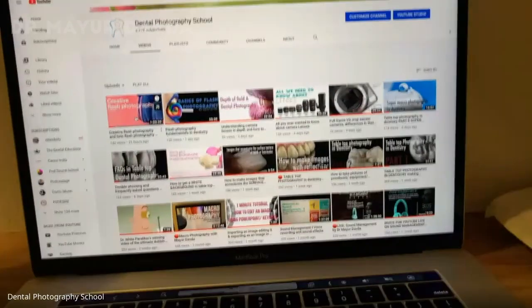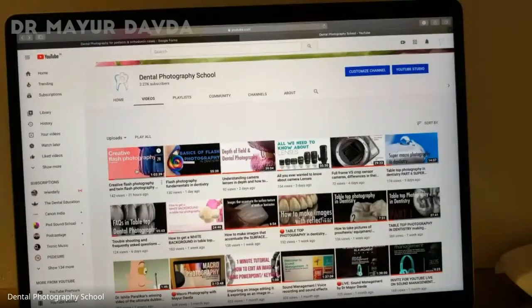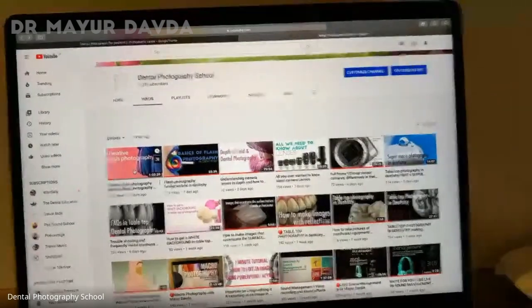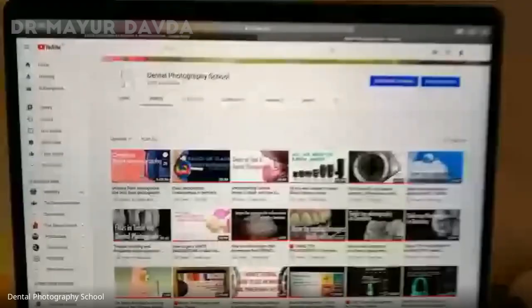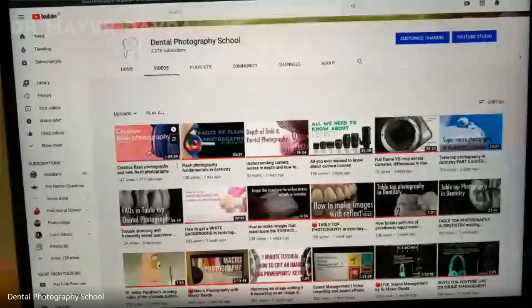Right, Nachi Shrithar. Sir, is it possible to see the white spot lesions clearly? Will flash hinder that? No, the flashes won't hinder that. If they hinder that, that means that your flash is very powerful. You can reduce the flash power. All right, but I have never had issues with it. If you still have it, you can send a video of what you are doing so that I can correct you.